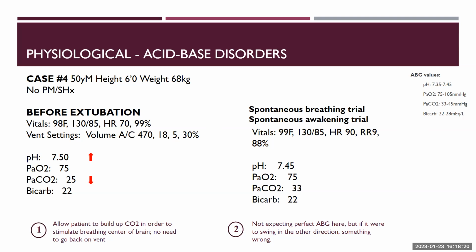Okay, it's basically going from whatever mode you are in to a base of PEEP. You're still trying to compensate for the fact that they're breathing through a tube and not naturally, so you give them support on top of that PEEP, and it comes in the form of pressure. That's why it's called pressure support and CPAP. The CPAP is the equivalent of the PEEP, and the pressure support comes on top of it. There are no parameters set for your respiratory rate because you want the patient to breathe, and you watch how they do as they try this.